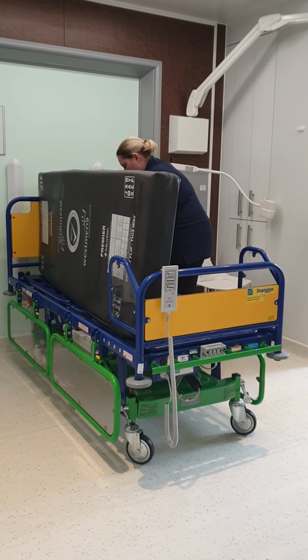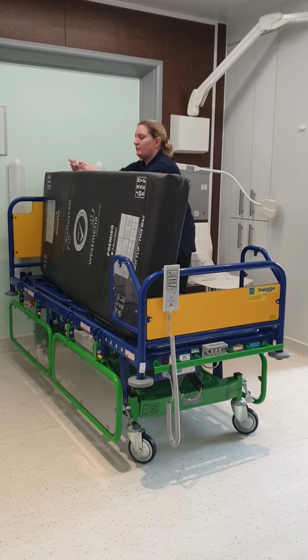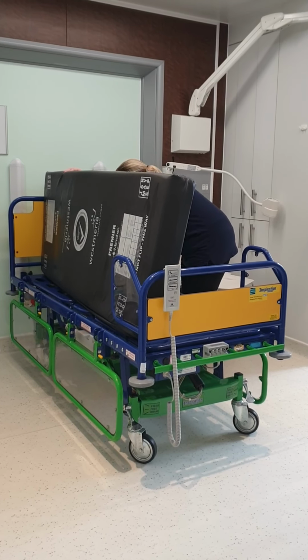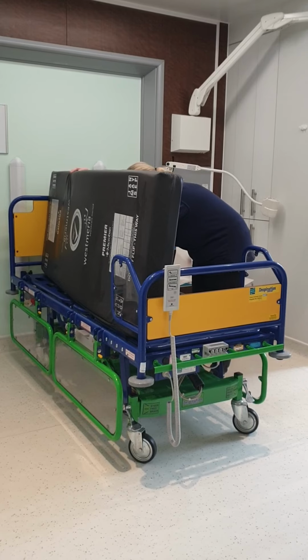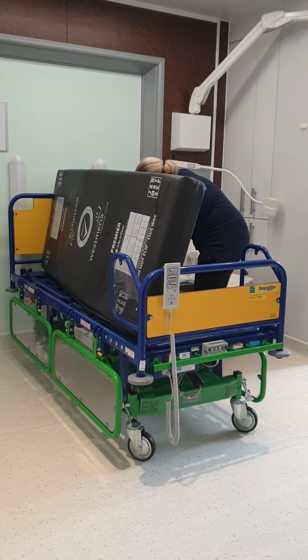If you see any specific areas that are contaminated visually before you start cleaning, clean these off initially in order to make sure that when you're cleaning everything else, you equally cover everything.